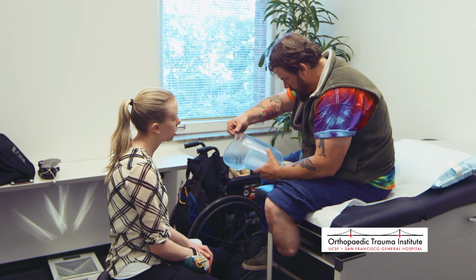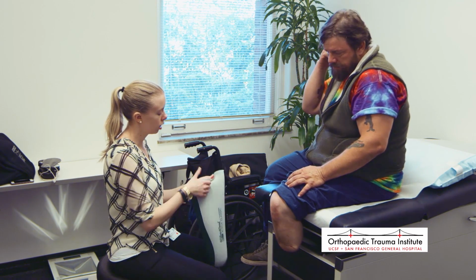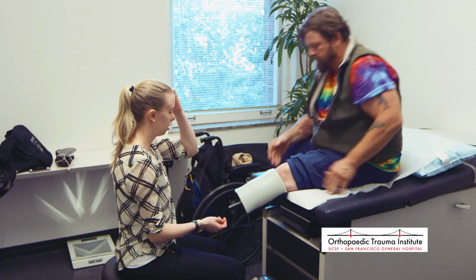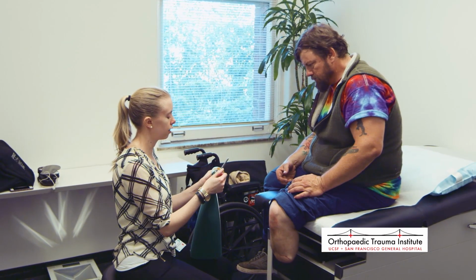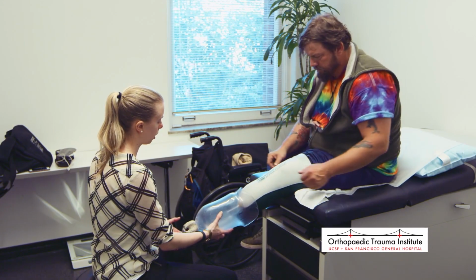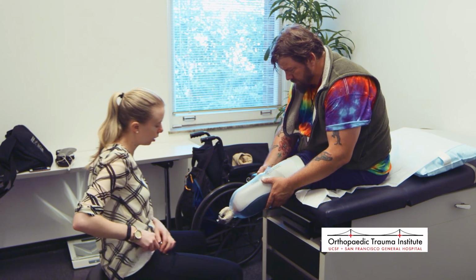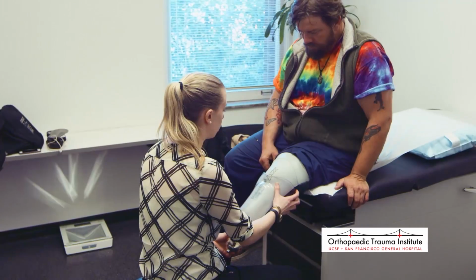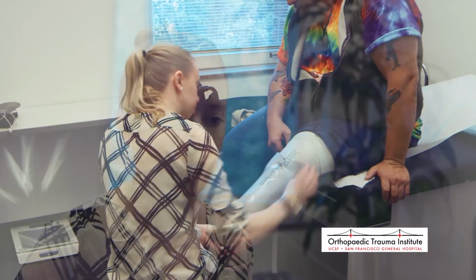Then I re-educated him on gel liner use and care, donning and doffing, explained about the pin lock, and did a little education about how the pin suspension works. I made sure he understood it initially, and then we put on the socket for the first time and did our initial test socket fitting criteria, where I test rotation and different force systems to make sure statically it's comfortable and not causing any pain. I evaluated the volume and decided to add socks.